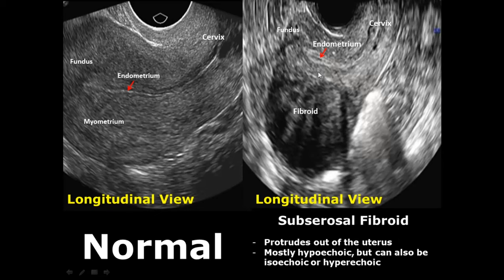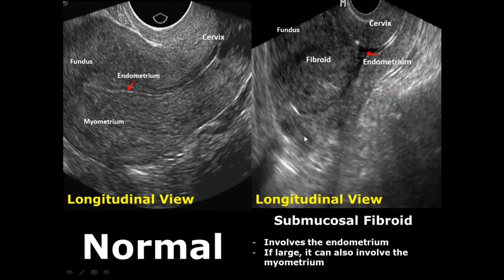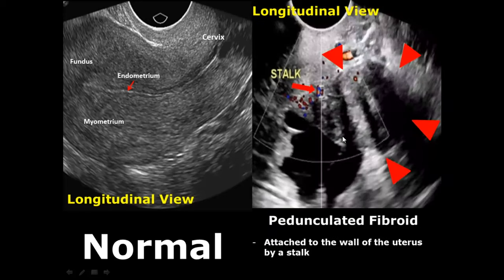The submucosal fibroid involves the endometrium but if large enough can also involve the myometrium. The pedunculated fibroid is present in the endometrial canal and is connected to the endometrium by a stalk — we can see blood flow within the stalk on Doppler scan. Some fibroids can also have calcifications, which produce posterior acoustic shadowing.